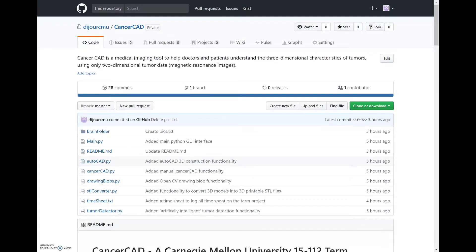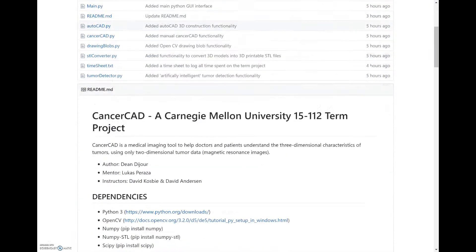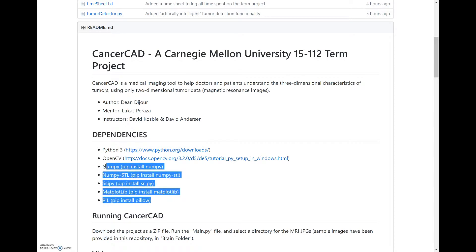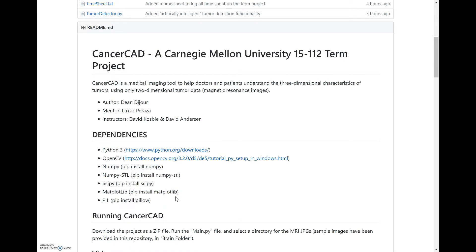Hi, I'm Dean. This is my 15-112 term project, CancerCAD. CancerCAD is a medical imaging tool to help doctors and patients understand the three-dimensional characteristics of tumors using only two-dimensional image data, which is essentially just MRIs.